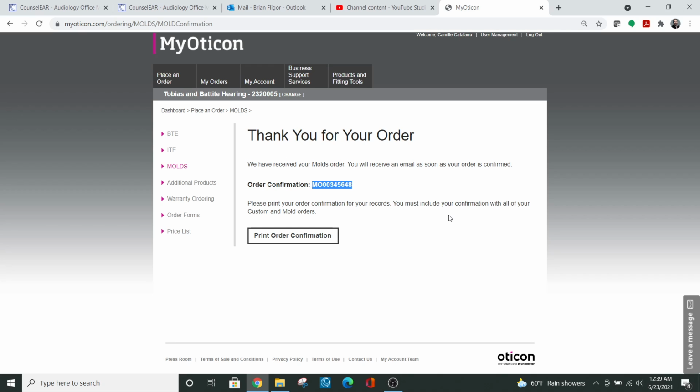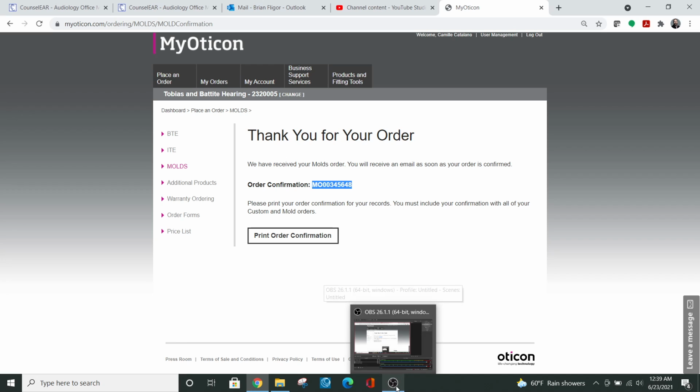I would far rather send something digitally, because now I have an order number right here that I can get in touch with my rep and say, hey, whoops, that was a mistake.